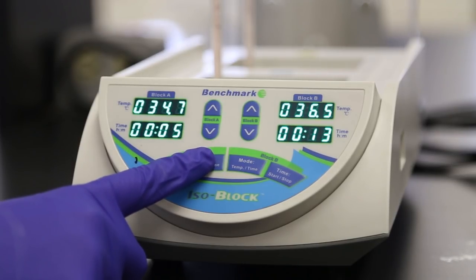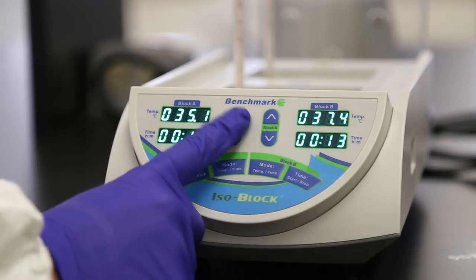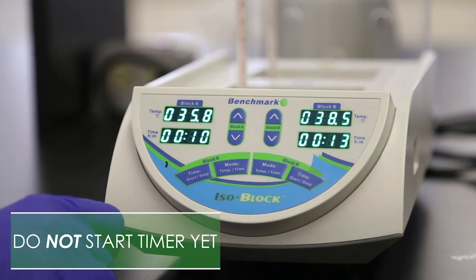The last digit of the selected setting will flash. Note, the display includes hours and minutes. Using the Block A arrow keys, press and hold the up or down to set the timer to 10 minutes. Don't start the timer yet.